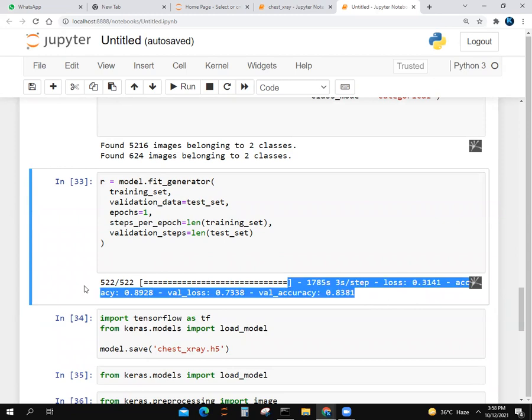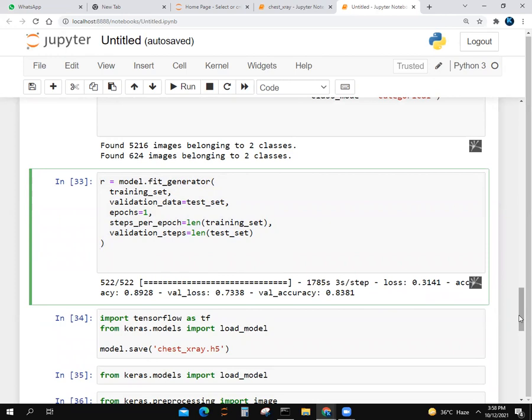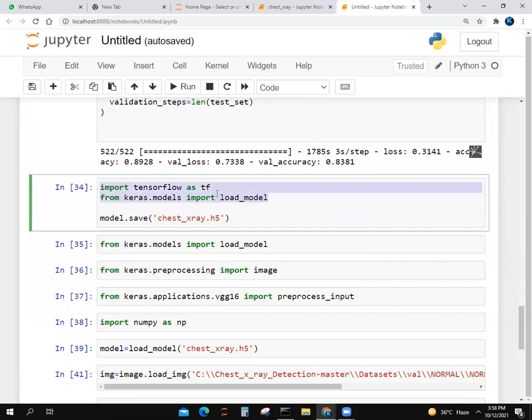It will take many times. It takes one and a half hours to run. After that, we import TensorFlow as tf and save our model as chest_xray.h5.